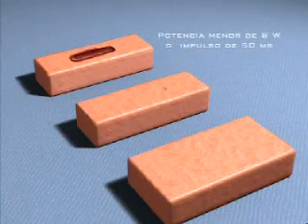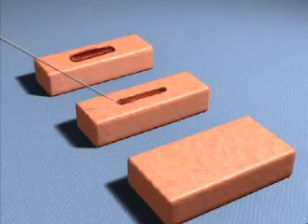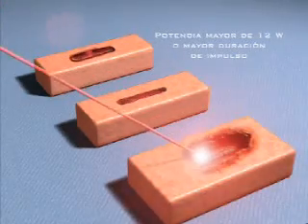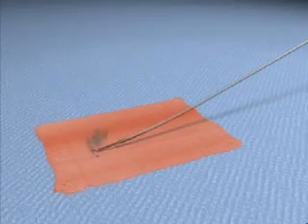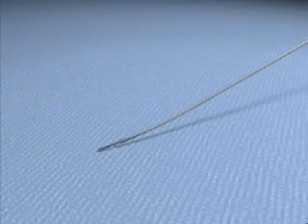A pulse width of 50 milliseconds will give gentle, precise incisions. Increasing the laser power above these levels will produce iatrogenic burns. For a faster effect on tissue at the initial contact, it may be useful to establish a microcarbon plane on the tip of the optical fiber by first firing the laser on the test material.